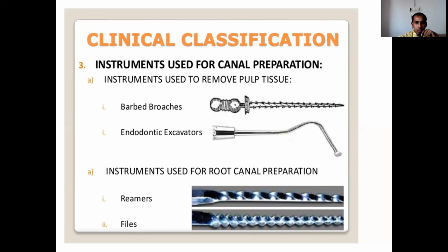And endodontic excavators are small spoon excavators, which are used to remove small obstructions present in the root canal orifices, and also to remove blood clot tissues, etc.